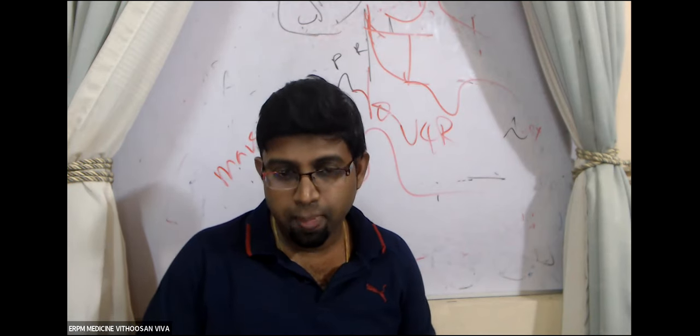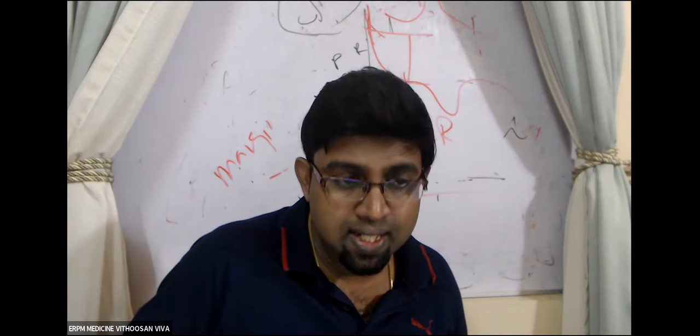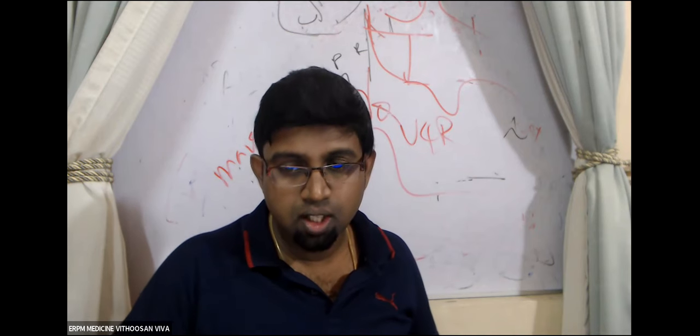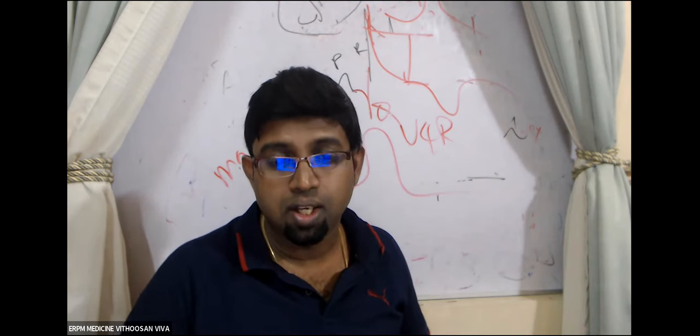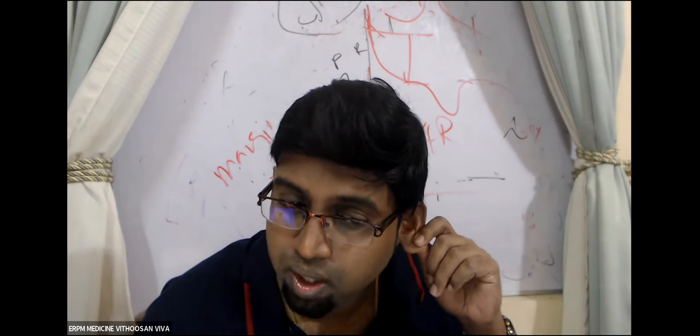Are you okay? Come on, guys. Understood. Now, when will you suspect a right ventricular MI? That's theory class knowledge. Answer. When the inferior leads show changes. Clinically, when will you suspect a right ventricular MI? Epigastric pain? When will you suspect it? When there is hypotension associated with a raised JVP.